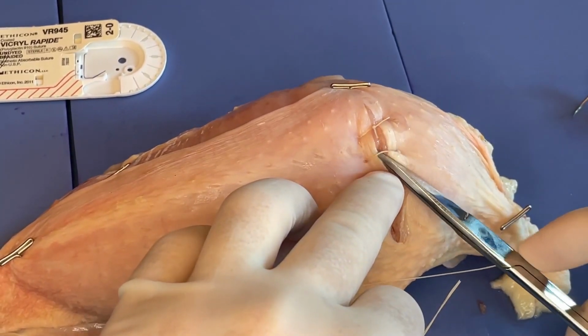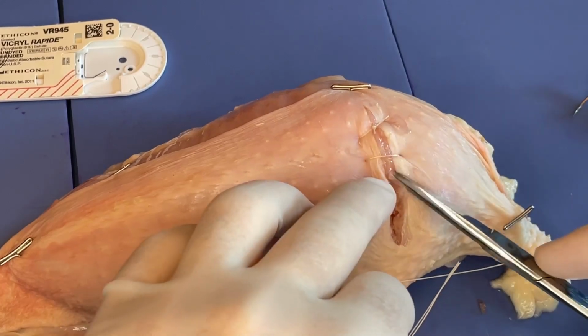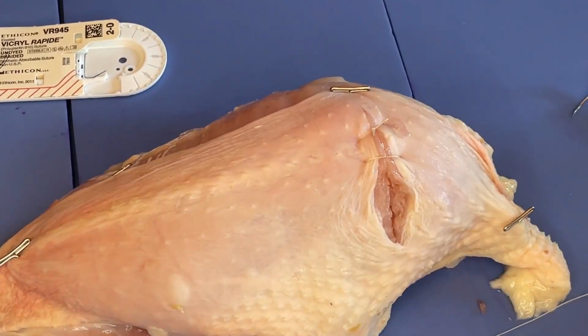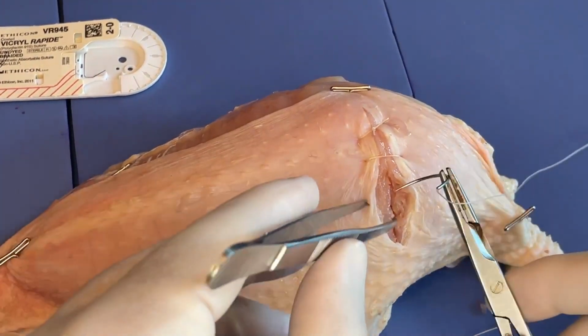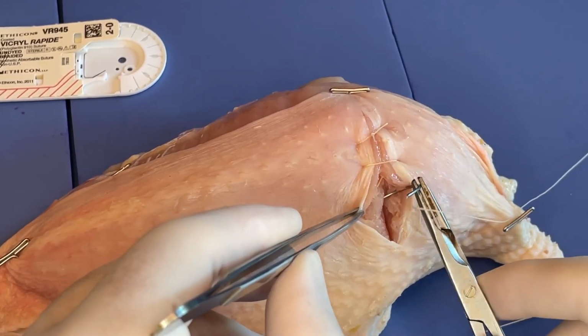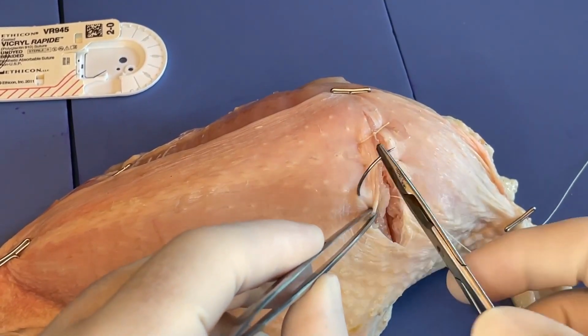So on the outside, we just have suture. Up here at this first one, we've got a visible knot, but here the knot's buried down in the tissue. So we'll just do another one of those quickly. Starting, instead of here on the right-hand side on the outside, we start on the other side, going inside to out.